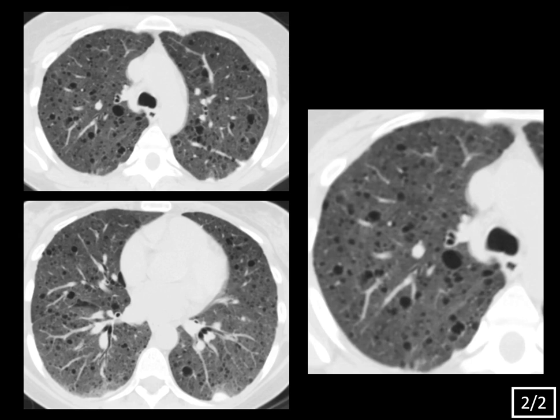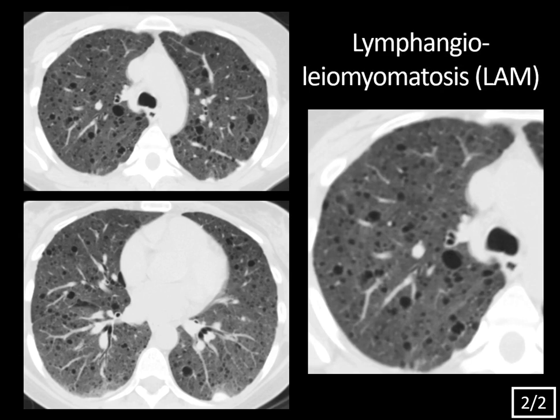In a female patient with tuberous sclerosis, this is typical for lymphangioleiomyomatosis, which for obvious reasons we tend to just call LAM. This is a rare multi-system disorder that can occur sporadically but often occurs in association with the tuberous sclerosis complex. If patients are symptomatic, they usually have exertional dyspnea. Two key complications of LAM are recurrent pneumothorax and chylothorax — a chylous effusion — and you might even see a dilated thoracic duct. The key is that the cysts are uniform and diffusely scattered throughout the lung.